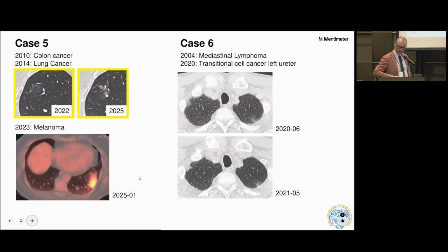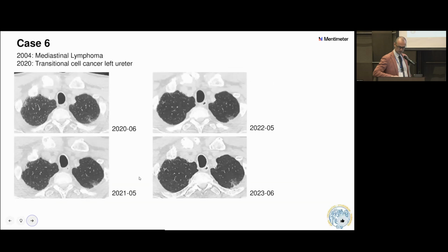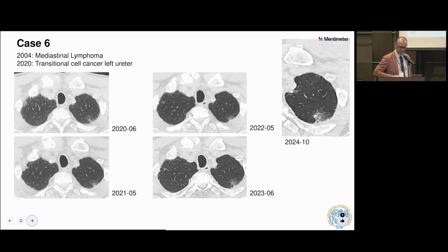here. 1 year later, the left upper lobe shows probably some minor increase in density, but who knows? We keep up with the follow-up, and the shape of this finding is clearly changing, whereas on the other side, we're quite stable. So we have a full 3-year follow-up period for this patient here. And again, 1 year later, even more solid component growing up.